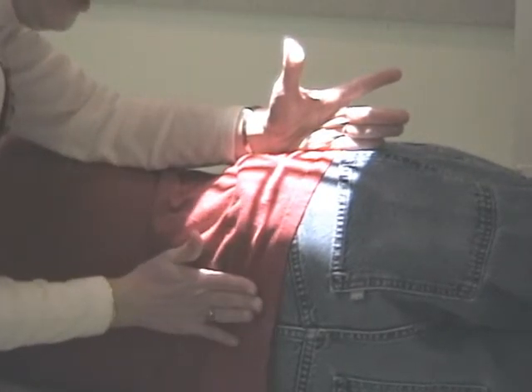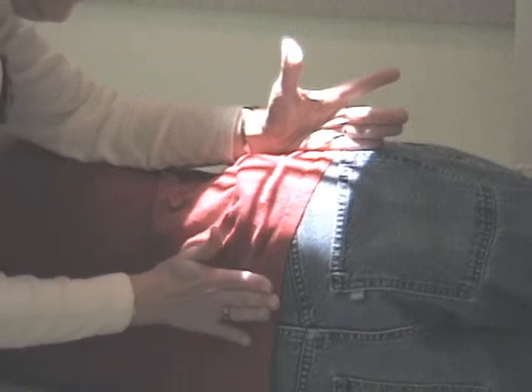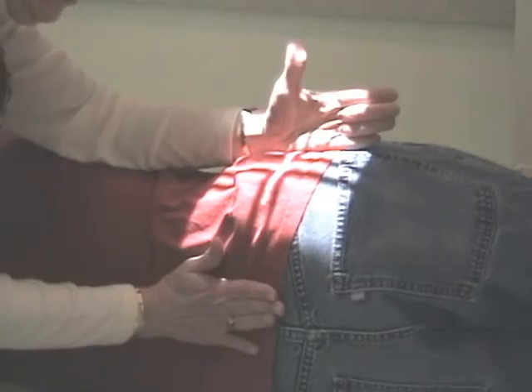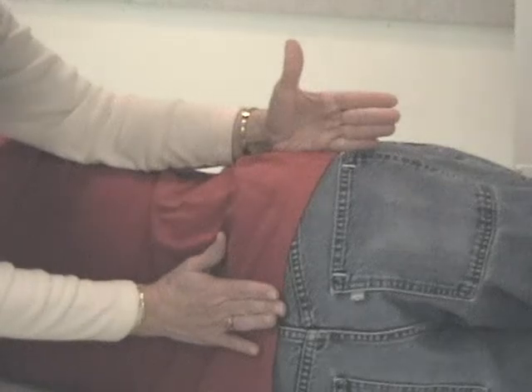Then you can palpate the posterior wall of the patient. This will help you if there's a lot of adipose. It'll help you give a judgment call. And the crosshair, this crosshair here, should go right between these two hands in a vertical plane. So if you look at this demonstration, I need to scoop my patient a little further away from me. Not much, but a little further away from me. And the table won't move, so we just will slide him just a little bit. There you go.